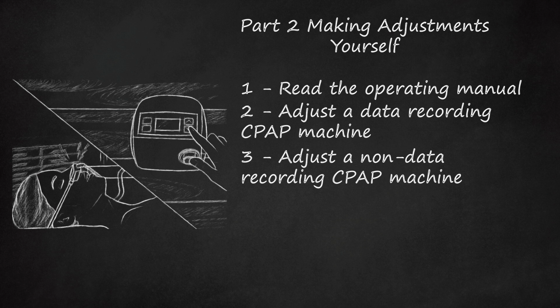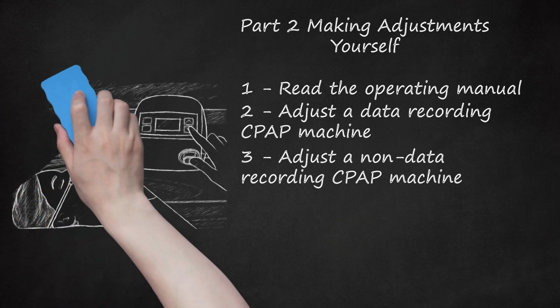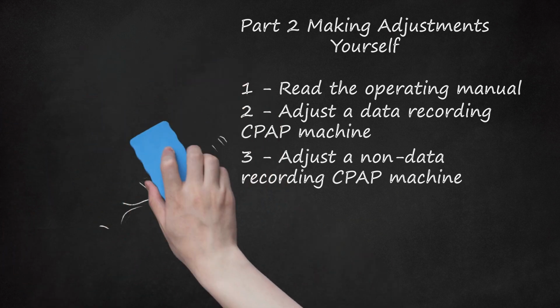In the vast majority of cases, people unhappy with the settings on their CPAP machine want to increase the pressure in order to get more air. In a minority of cases, people may want to lower the settings because the pressure is too great and creating noisy leaks from their masks, causing bloating or leading to excessive dry mouth.